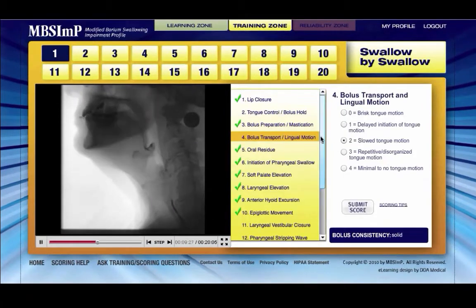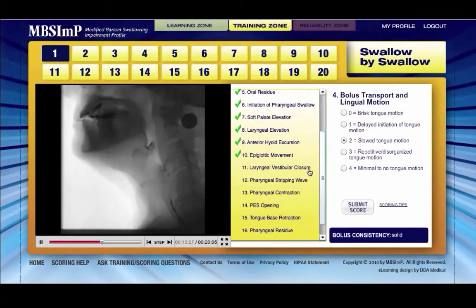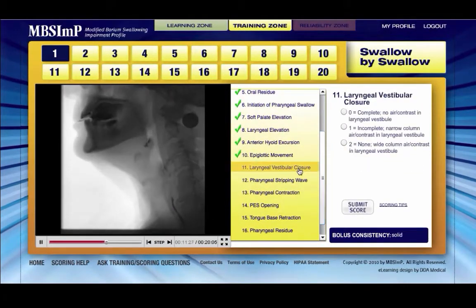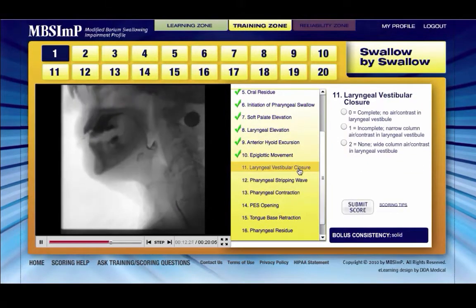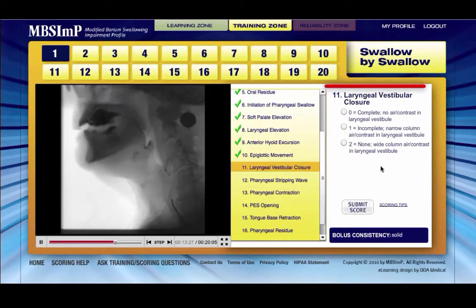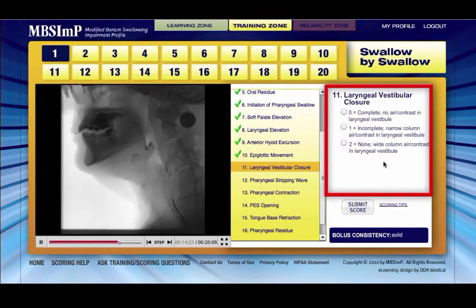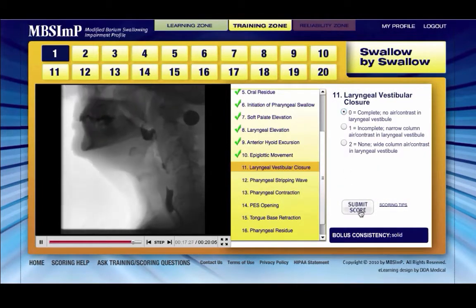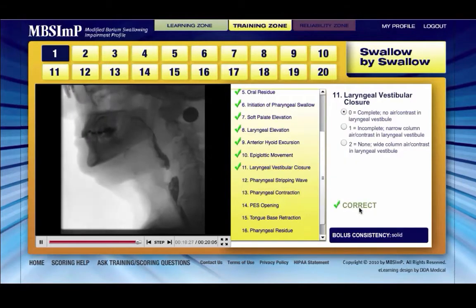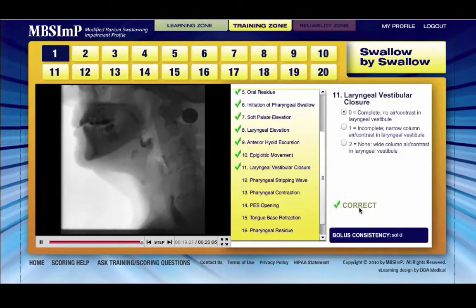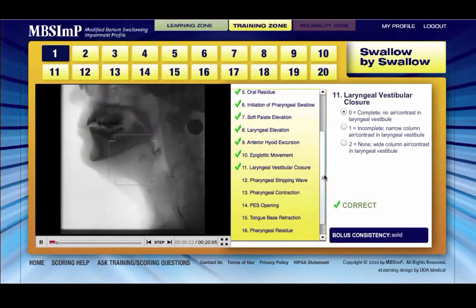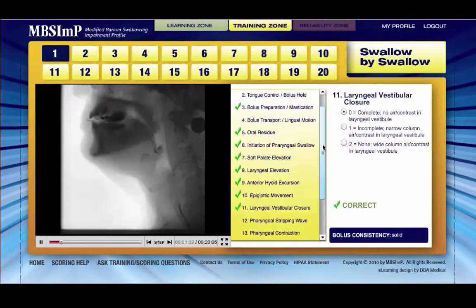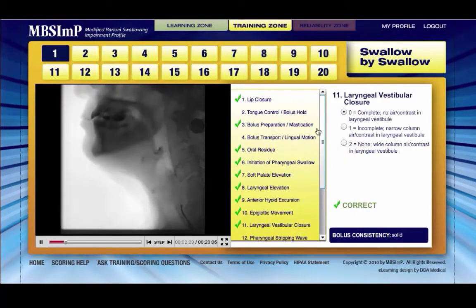Hover your cursor over the scoring tips link to reveal scoring guideline reminders for certain components. When ready to score a component, choose the desired component in the list next to the media player and the associated scores will populate to the right. Select the score of choice and submit.